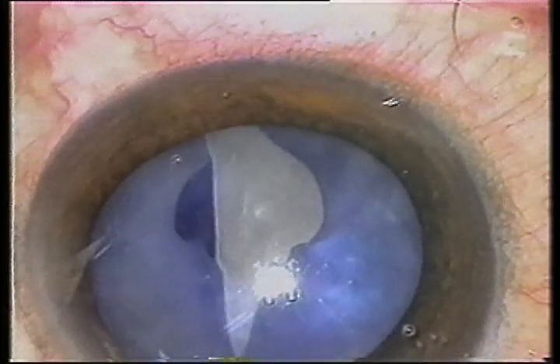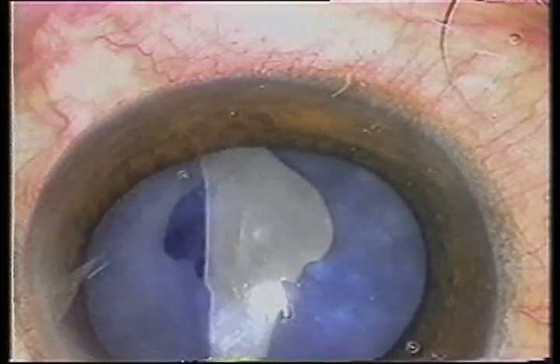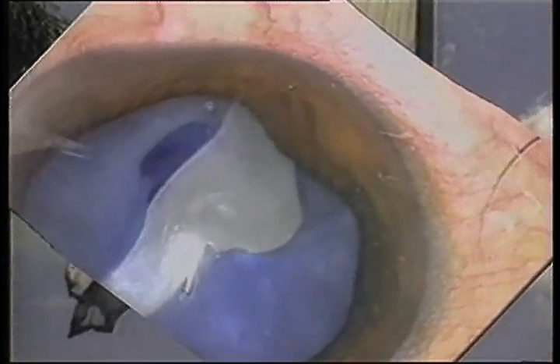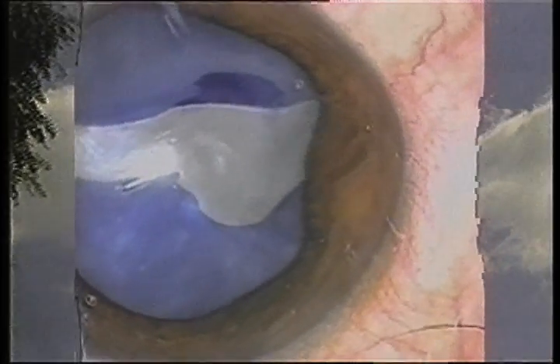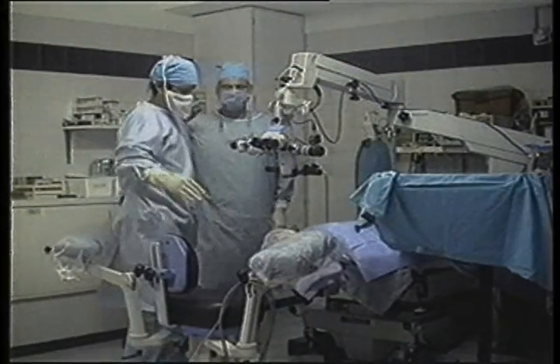In the year 2000, Perón and Albertazzi, in a great video, introduced the Argentine flag sign. Up to now, there has been no explanation for the mechanism that justifies the appearance of this sign, nor has there been a technique to avoid this complication. Not that we dislike this flag, but here in Brazil we have tried really hard to avoid this unpleasant sign.